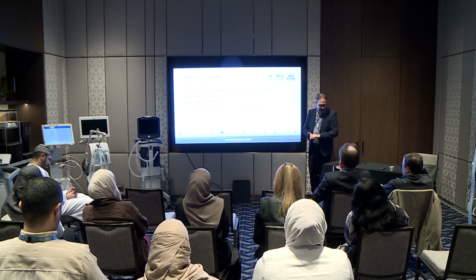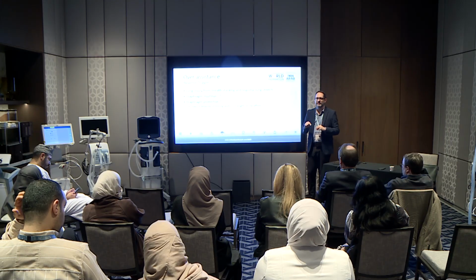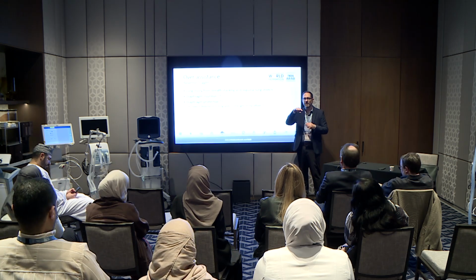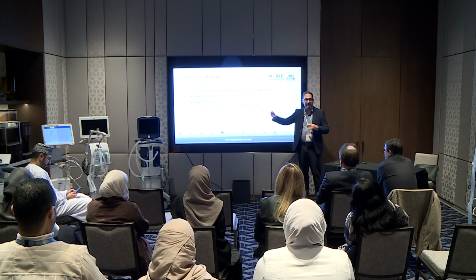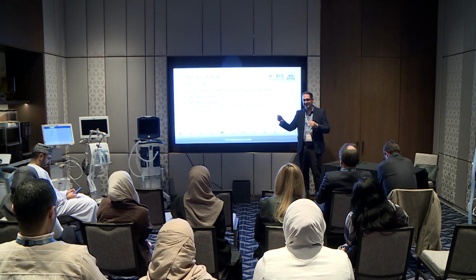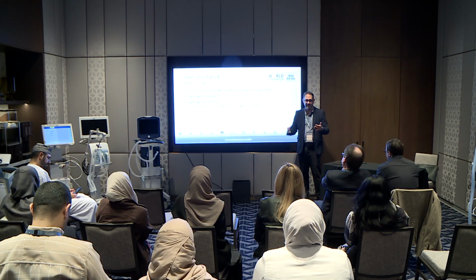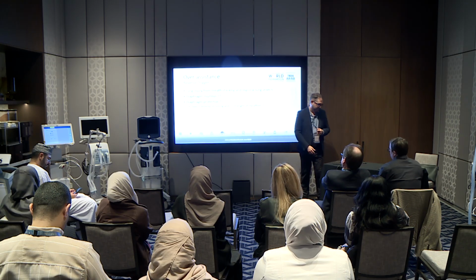Diaphragm protective, there's some nice data from my colleague Felipe Damiani looking at how it actually matters how strong the reverse triggering effort is. So in an animal model, if reverse triggering was associated with a strong effort, the effort that's more likely to cause breath stacking, there was diaphragm injury, not just lung injury. But with the weak effort, it was actually diaphragm protective. So again, just because you see reverse triggering, sedating or paralyzing is not the answer. It may tell you that it's okay, the diaphragm is okay, and it may tell you that they're ready for transitioning to pressure support.